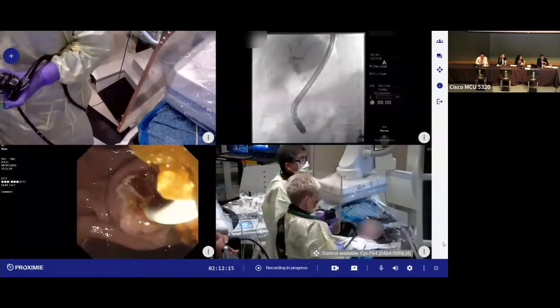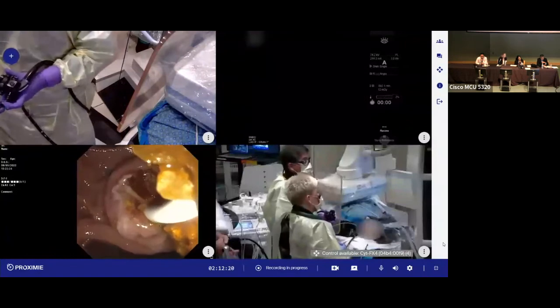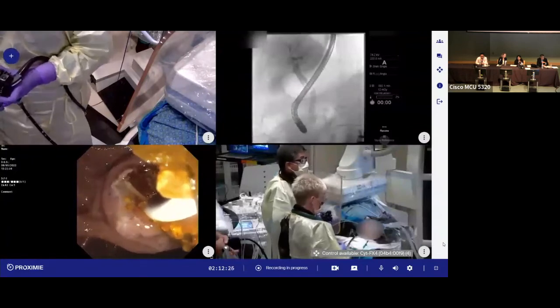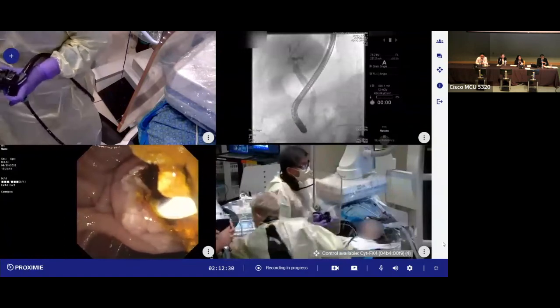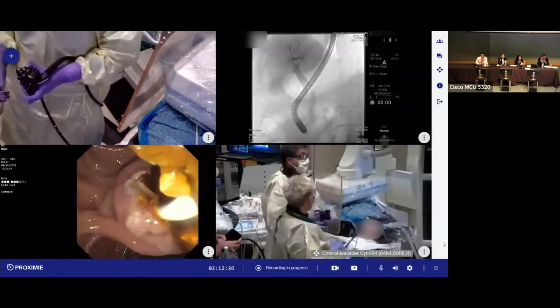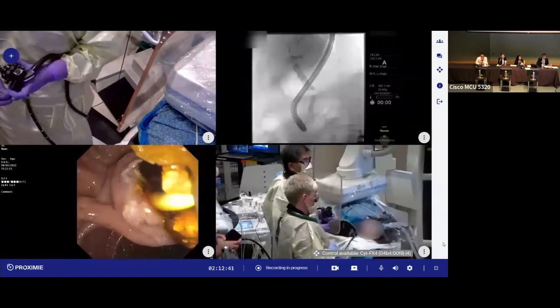So I'm trying to do intermittent fluoro here as we're doing the occlusion cholangiogram. You don't want to do too much injection, but enough to prove that there are no more stones left. Sometimes if we do mechanical lithotripsy, especially intraductal, we'll do sterile saline irrigation. But we don't really have to do mechanical lithotripsy, so I think we're okay.